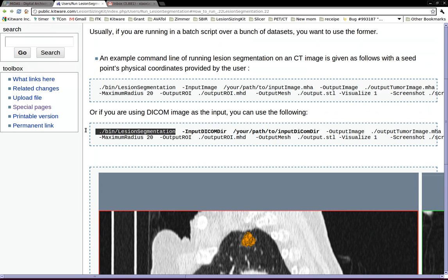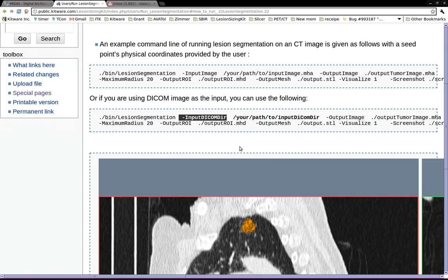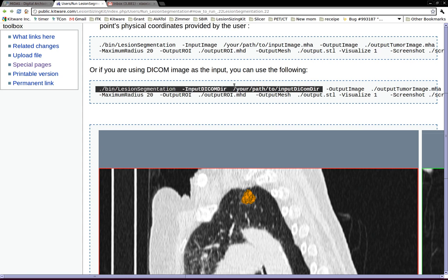If you have a DICOM image, make sure you use this tag, inputDICOMDir, and then the path to your DICOM images. If you're using meta image, just say inputImage.